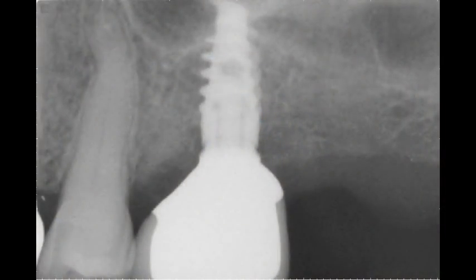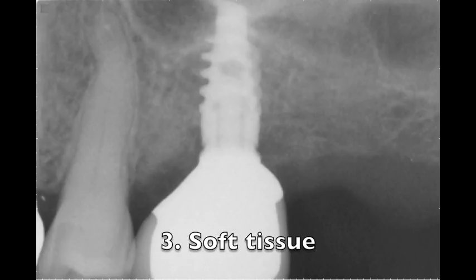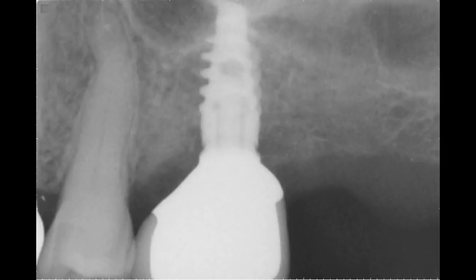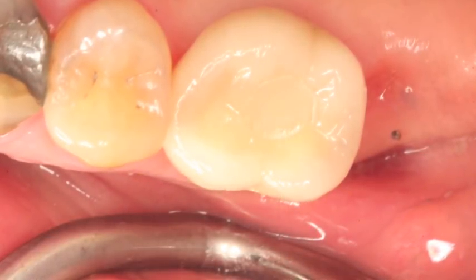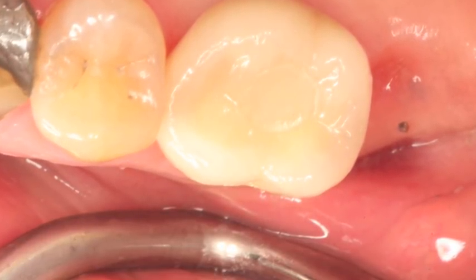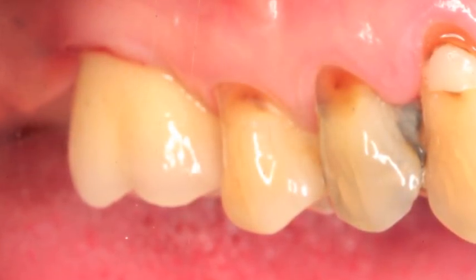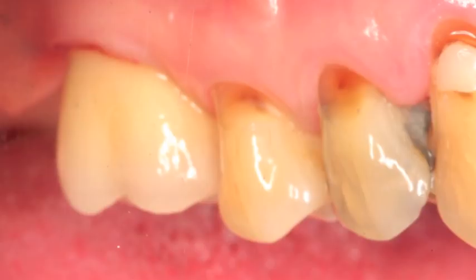At this point there could be three things that usually stop you from seating this crown. First, the contact point could be pushing you laterally, meaning you can't get the conical connection down and inside. Second, the bone could stop you from seating this crown. And last but not least, the soft tissue in this case in particular could be pushing you sideways and stopping you from getting this crown down into the conical connection and into the hex. We have to check all three of these areas, and then we can also check the occlusion — if the patient bites together and the occlusion feels quite good, then we know that we have a winner. Here's our beautiful crown, and this is what we try to get every time.